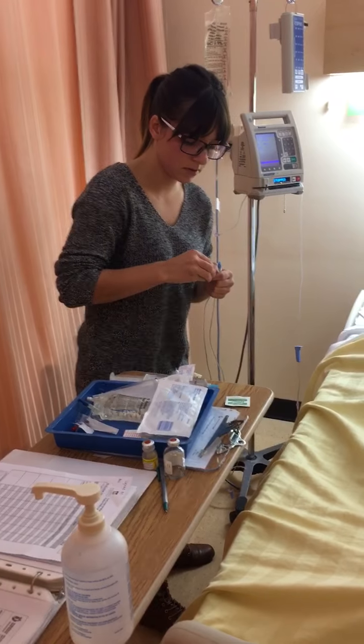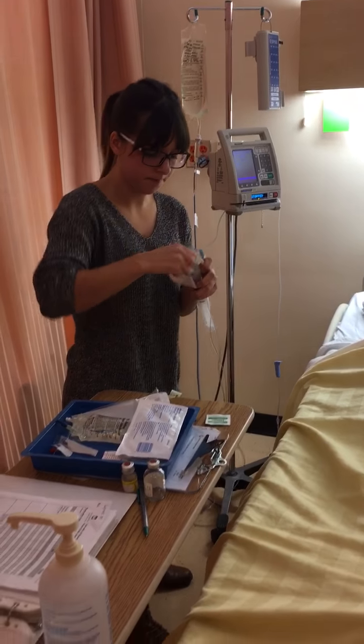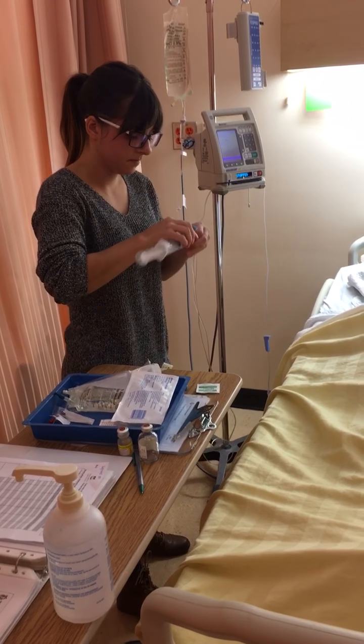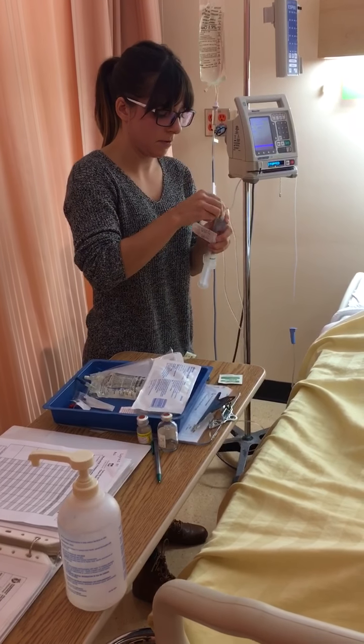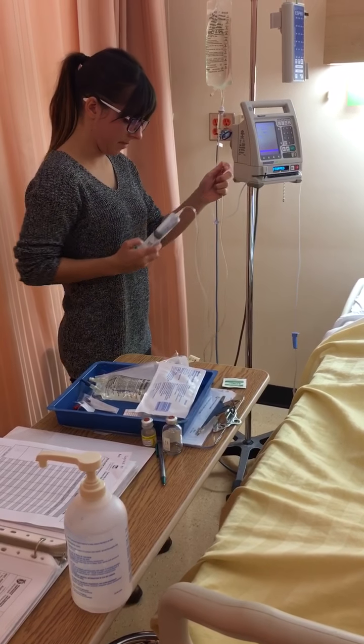I have my right patient, right drug, right dose, right route, intravenous, and the right time. While I'm priming my line, I want to make sure there are no air bubbles within my line.